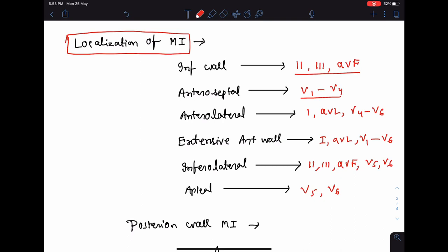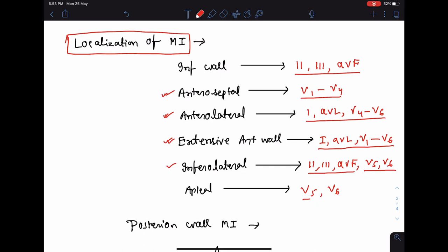Lead 1, AVL, and V4 to V6 indicate anterolateral wall involvement. Lead 1, AVL, and V1 to V6 indicate extensive anterior wall involvement. And if only V5 and V6 show changes, this indicates involvement of the apical wall.